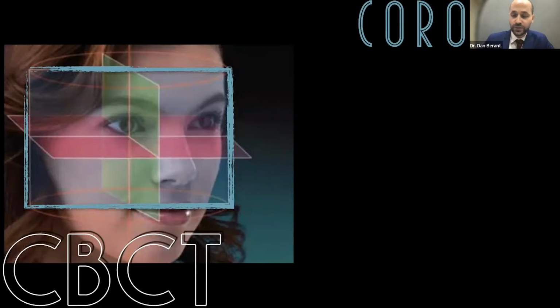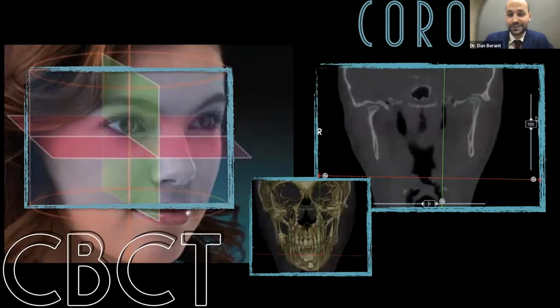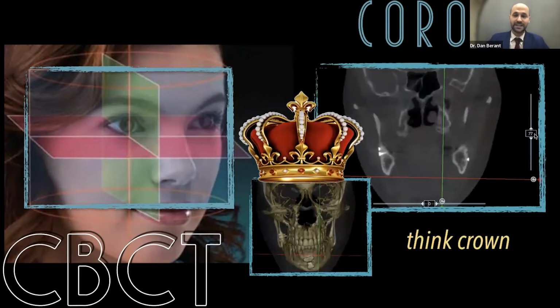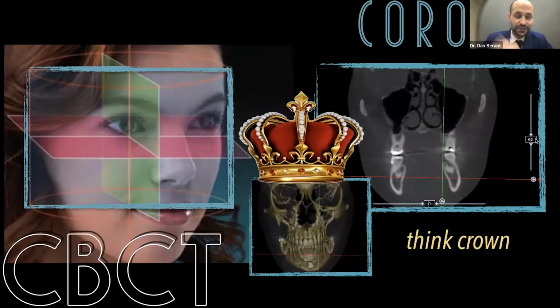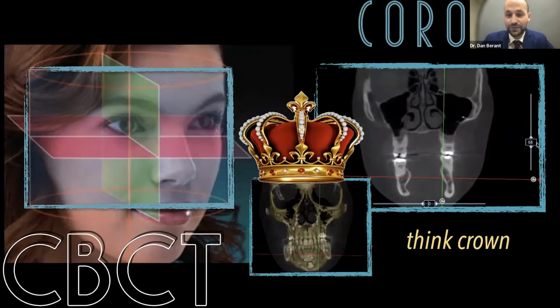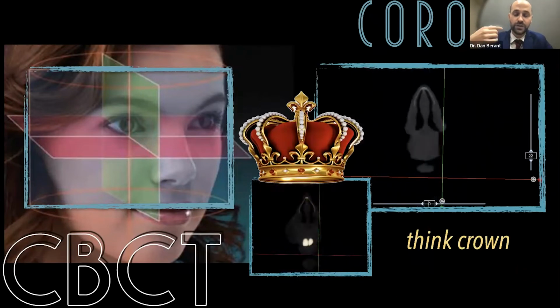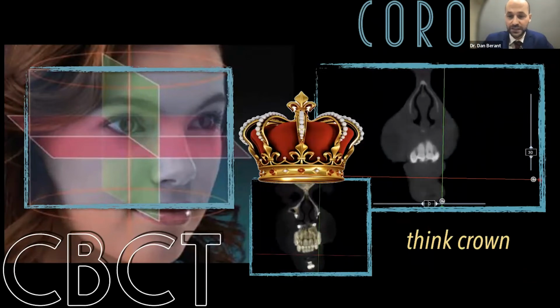So the first one is coronal. Now, coronal, I like to think of a crown on top of your head. So it goes and it's taking sections. CBCTs are a dynamic thing. So I have a video here to showcase us going forward and backwards through this patient's CBCT. So for the coronal view, think crown.